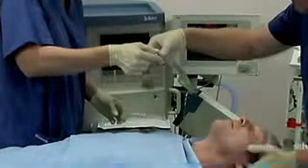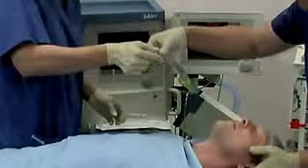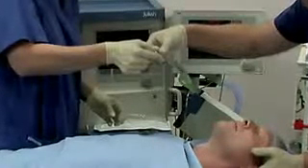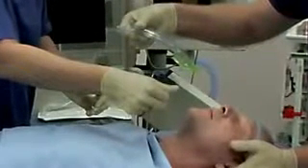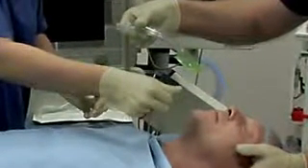Insertion technique. A proficient user can achieve insertion in less than 5 seconds. Remove the iGel from the protective cradle or cage pack. Grasp the lubricated iGel firmly along the integral bite block. Position the device so that the iGel cuff outlet is facing towards the chin of the patient.